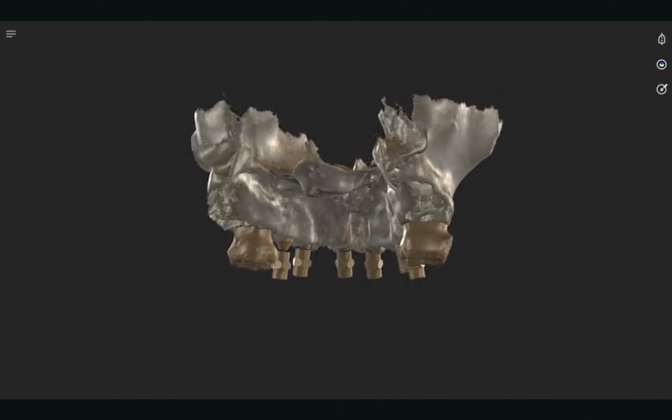A combination between surgical planning and aesthetic planning. Because for a long time, people have placed implants and found the best bone, and then we figure out afterwards how we are going to get something on there on the top. This allows us to see that end point before we even place anything.